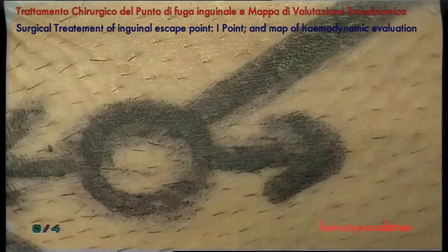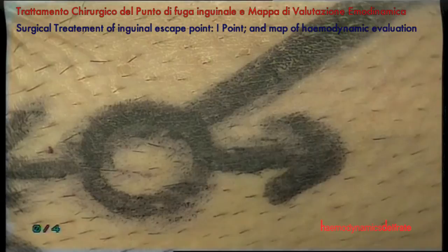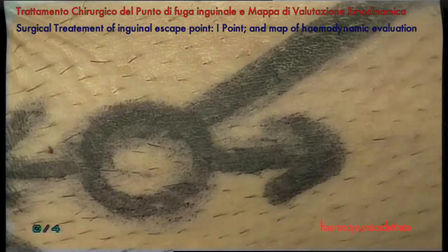Subsequent phlebectomies and sclerotherapies to the thigh and to the leg. You will see the hemodynamic evaluation afterwards.